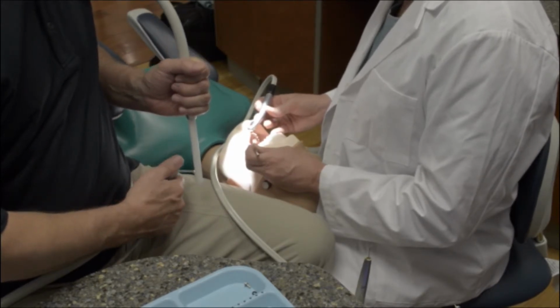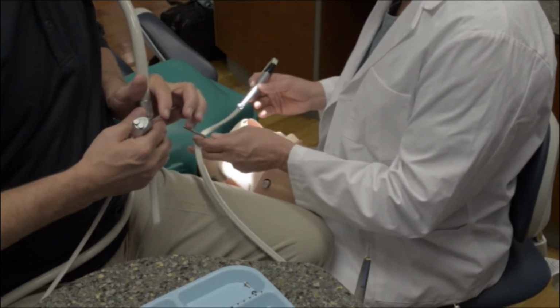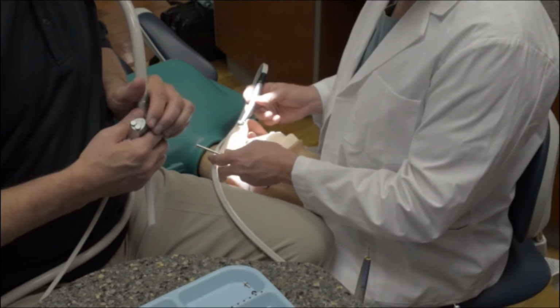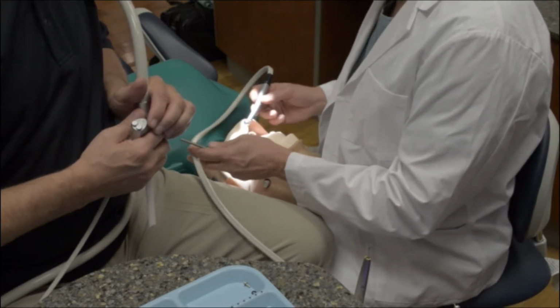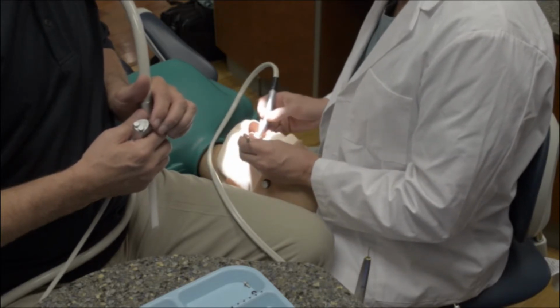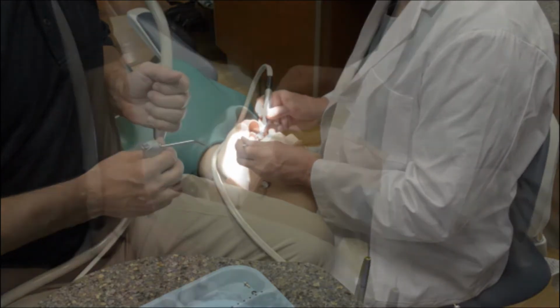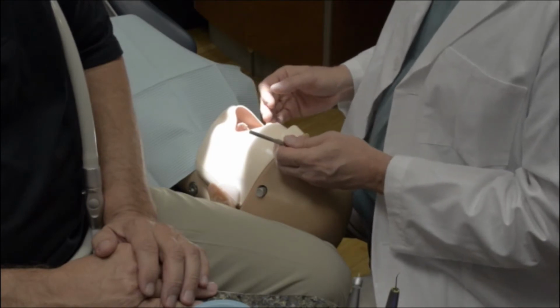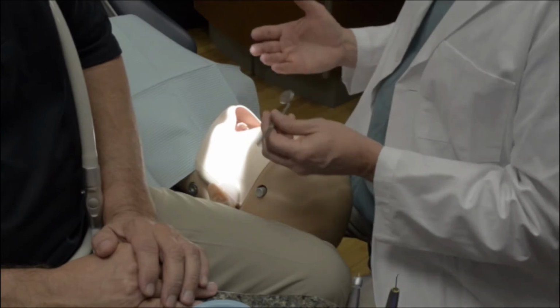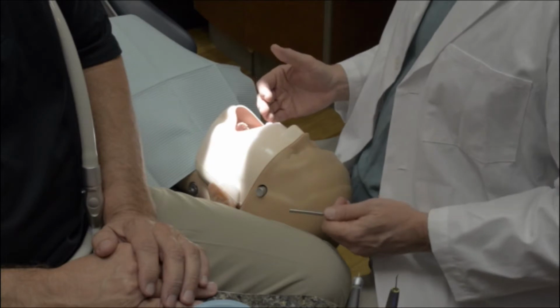Additionally, we would have told the patient at this point that they may be feeling a bit of cord laying on their patient drape. We don't say laying on their chest or their neck. We just refer to it as the patient drape. And in this way, the patient is not surprised when they feel any tubing. If you don't care to use the method that has the tubing draped on the patient drape, then the alternative to that is to have the handpiece delivered behind the patient.